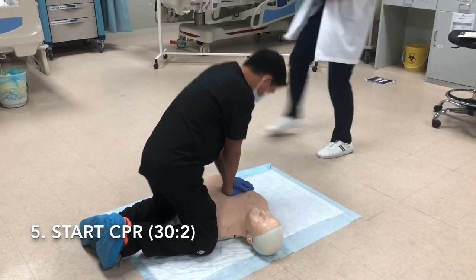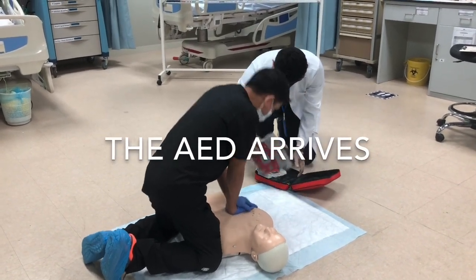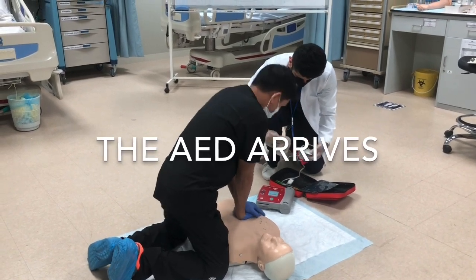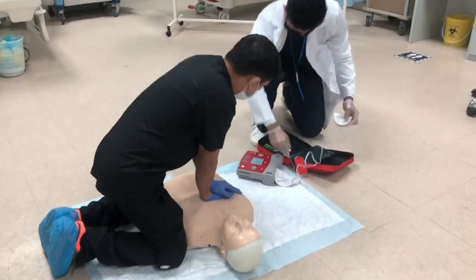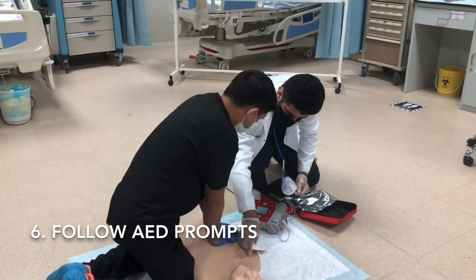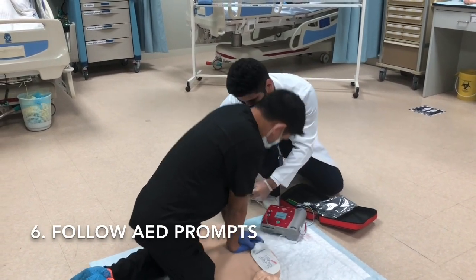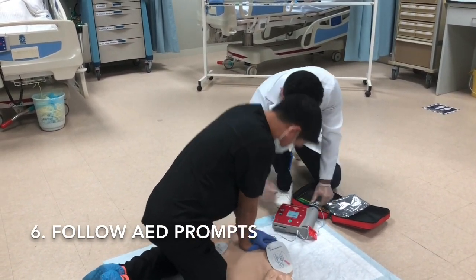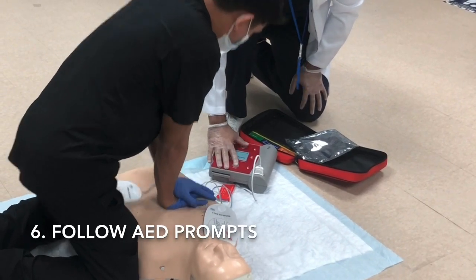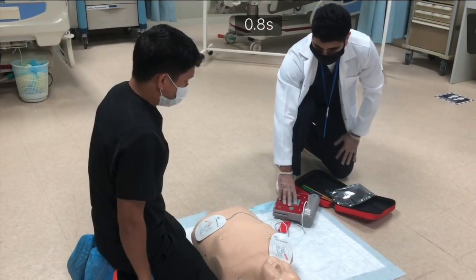CPR chest compressions performed — counting through thirty compressions. Remove clothes from patient's chest. Attach pads to bare skin exactly as shown.